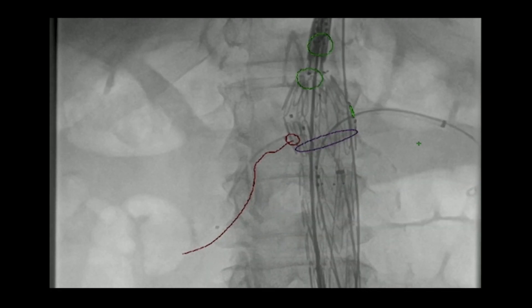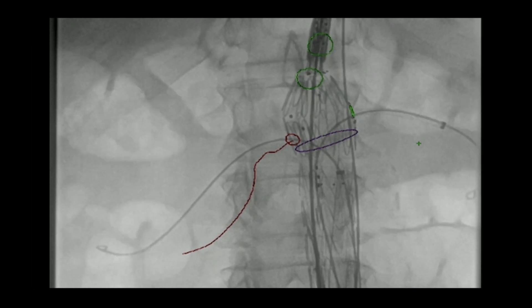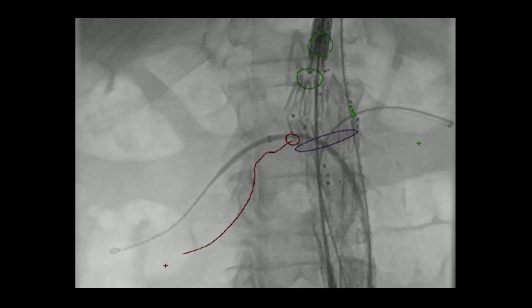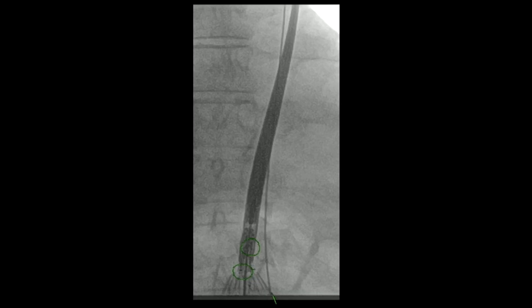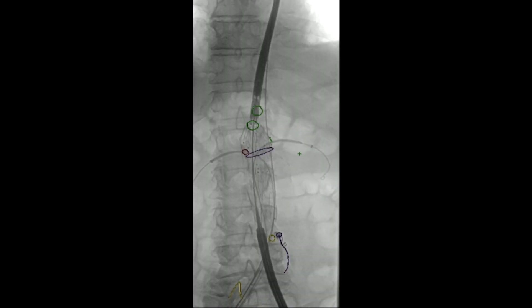Attention now turns to the right side — same puncture to the diaphragm of the sheath. We did exactly the same thing on the other side; in fact it was easier to wire the fenestration on that side because they were very nicely aligned. The key is alignment — that's what can really hang you up for a long time, trying to wire these renal arteries. We have the Rosen wire, the sheath advanced and dilator removed. We will then place two VBX stents. Checking there was enough wire up and over the aorta, we go ahead and deploy the fen — the VBXs are in the sheath in position.